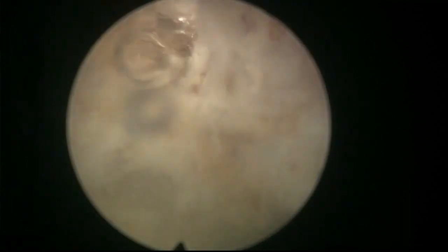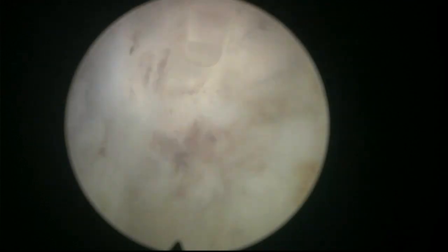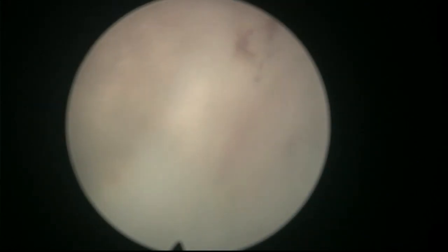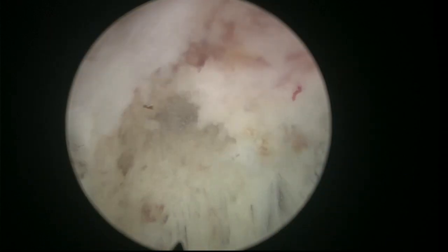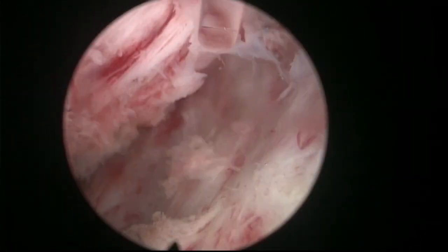It takes a little while to release the apex, but once the apex is released, we can relax and proceed to enucleate the adenoma from the capsule following this circumferential line of dissection, line of attack. Here I'm coming anteriorly. There are still some fibers at 12 o'clock. And let's see if we can cross towards the other side. You see, that's the other side. So we're nearly finishing the apical liberation.